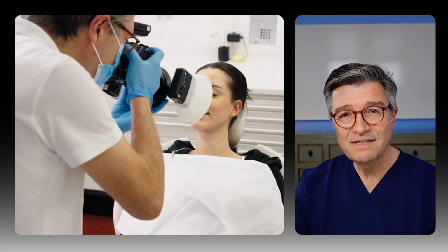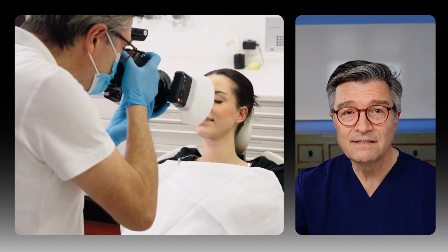Photography and video in dentistry are not just for marketing. Yes, they are great tools for social media, branding, and patient education, but their clinical role goes much deeper. Photography in dentistry is diagnostic, educational, and legal.